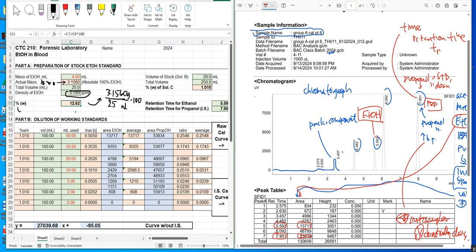All right, so why are we doing this? Well, the legal limit is 0.08%. It is in terms of percentage. Therefore, at some point in time, we're going to have to report our numbers in terms of percentage. And this is the first step in that direction. Now, this was way too strong to analyze on the machine, and it would just skyrocket our samples extremely high, and the data doesn't make any sense.